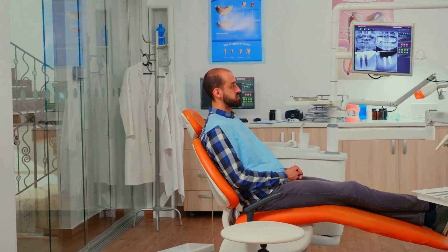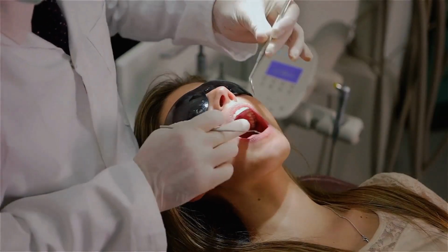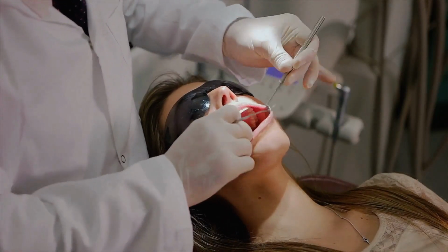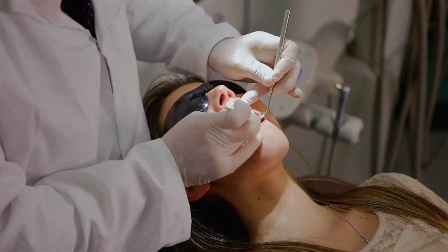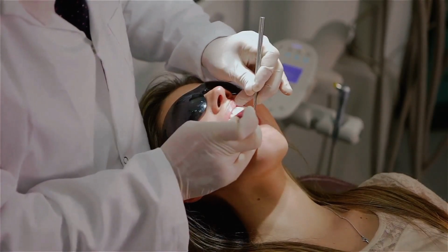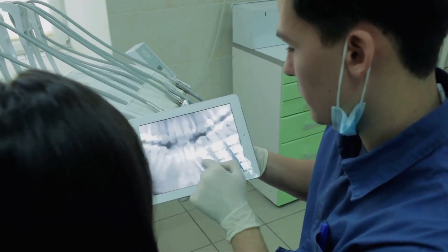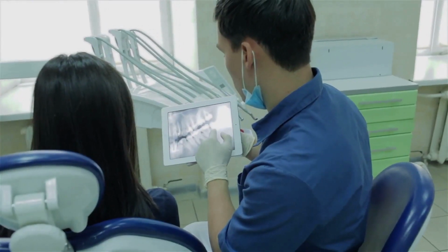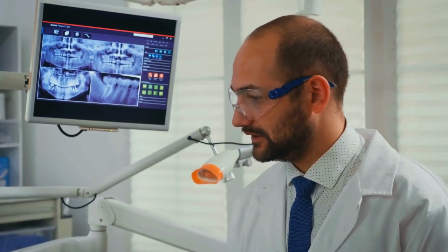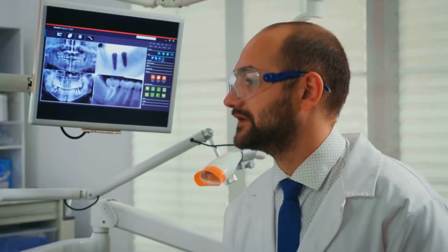Moreover, cross-polarized photography can be instrumental in explaining treatment options and demonstrating the potential outcomes of various procedures. For instance, when discussing restorative options, dentists can show patients images of similar cases treated with different materials or techniques, highlighting the aesthetic and functional differences. This visual approach allows patients to visualize the potential results of their treatment, enabling them to make informed decisions based on a clear understanding of the options available.